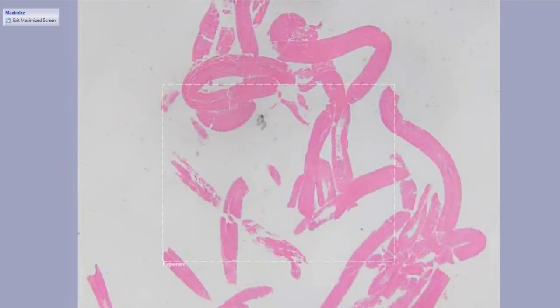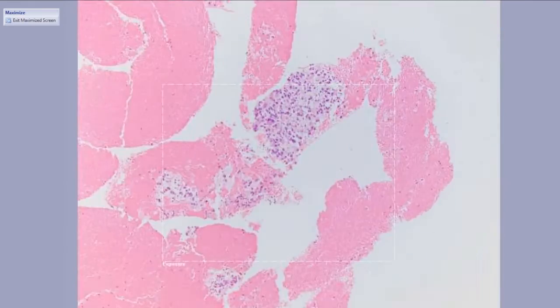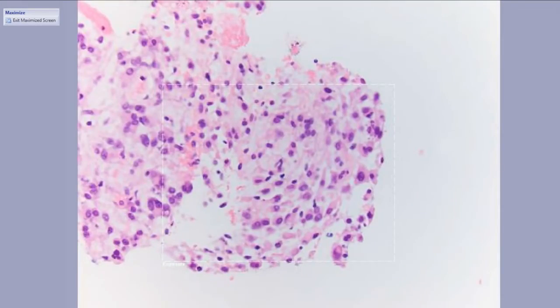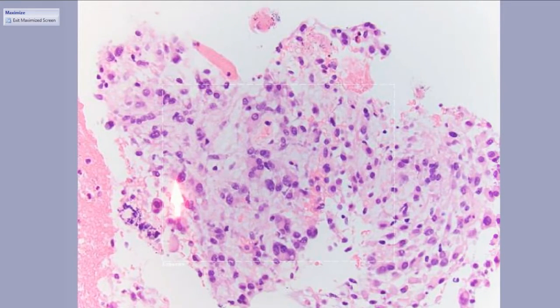Moving on, yet another stomach mass. And rather than a resection, this is a core biopsy. They saw something submucosal, and with their good strong arm, they tried to take a biopsy. And as unfortunately often happens, it's mostly blood, but we actually do get a little bit of lesional tissue here. And we can see this is very epithelioid, very rhabdoid looking actually, or at least to me, there's this fat belly of bright pink cytoplasm.